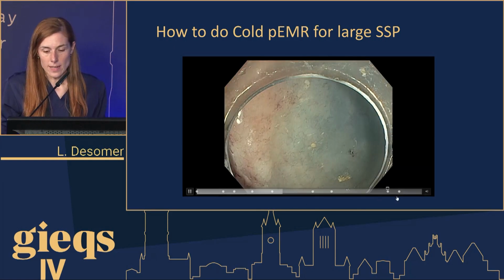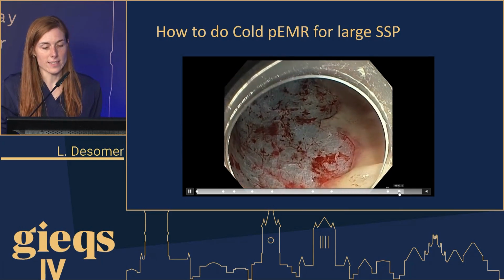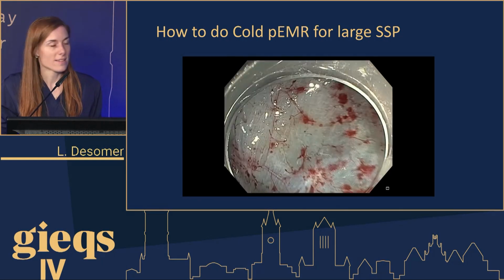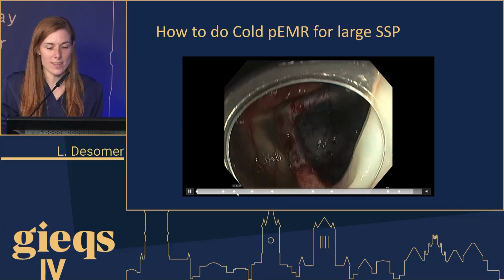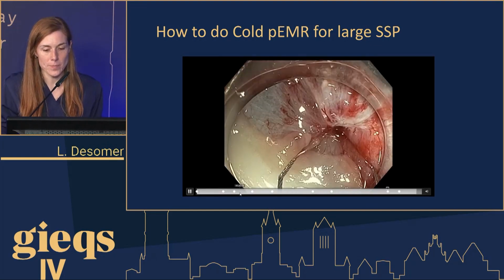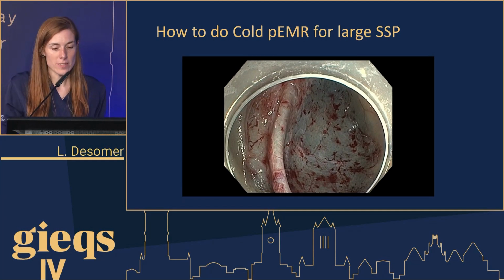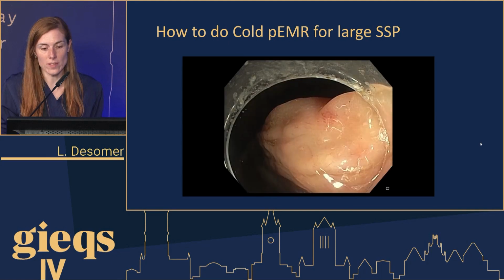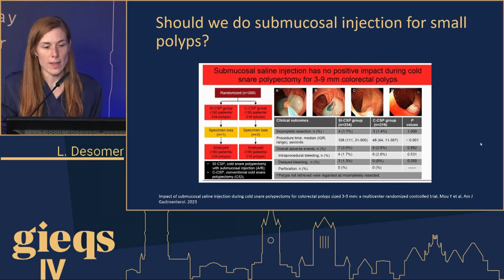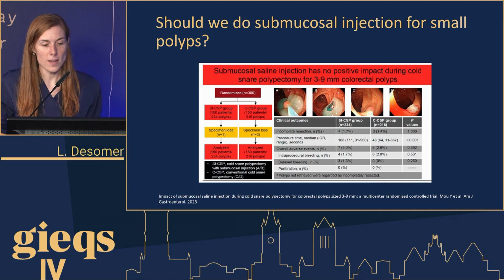And I think I'll have an image of it at the end. So look at that. That is just beautiful. Really done in expert hands again, but this is what the defect should look like. And as you can see, margins are inspected again and again, just to make sure we have the entire polyp.